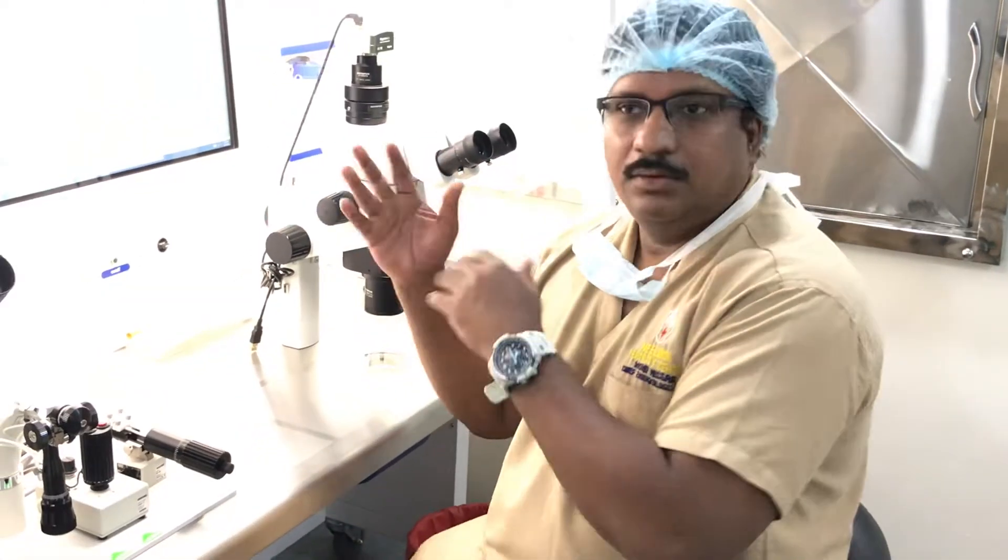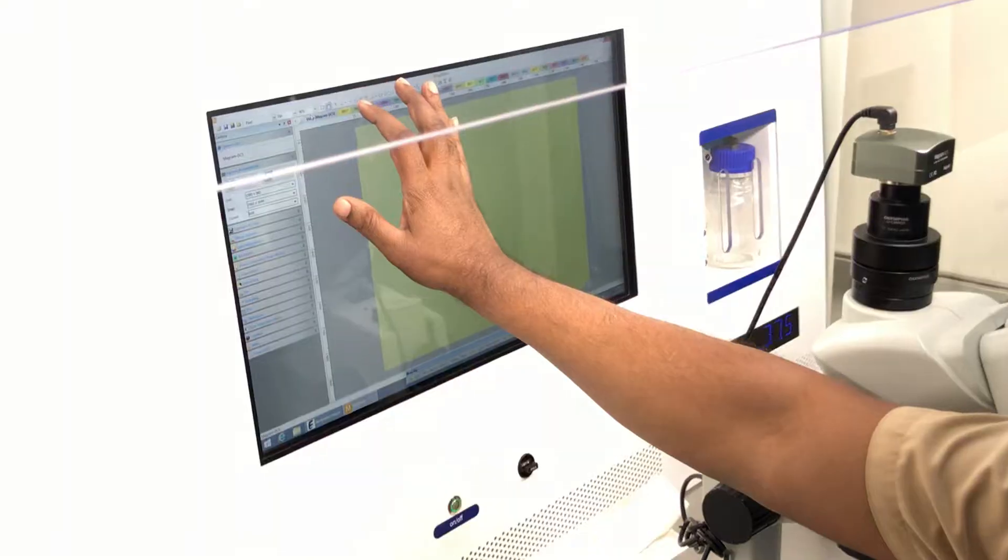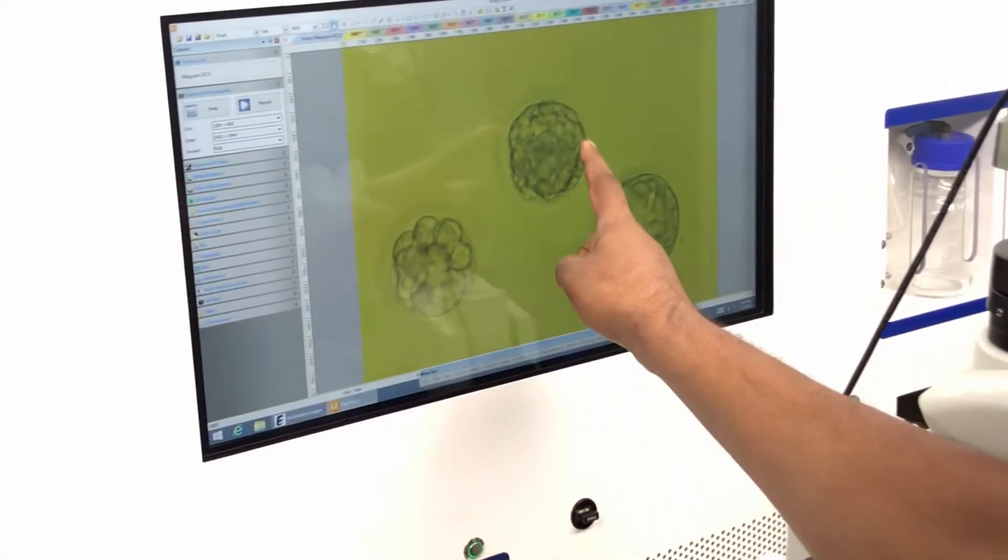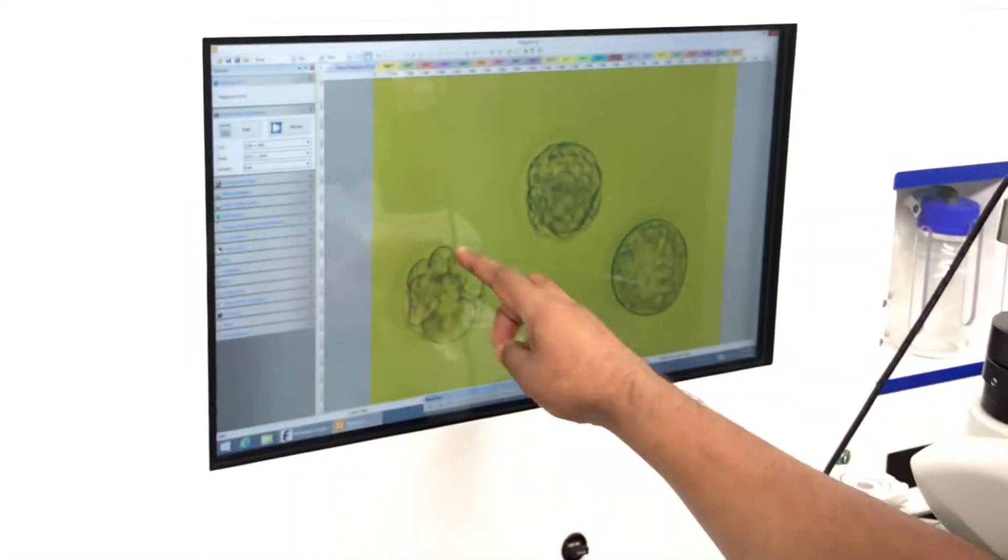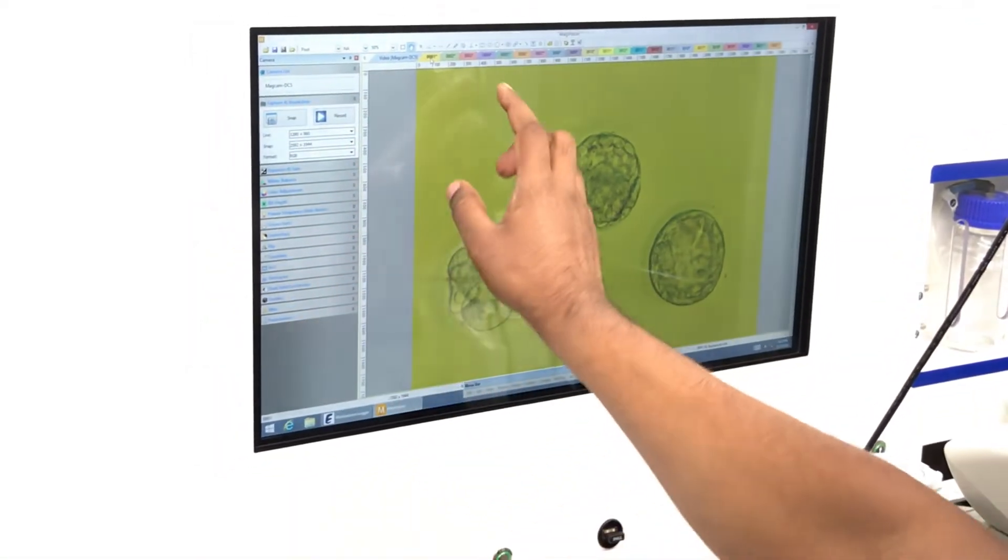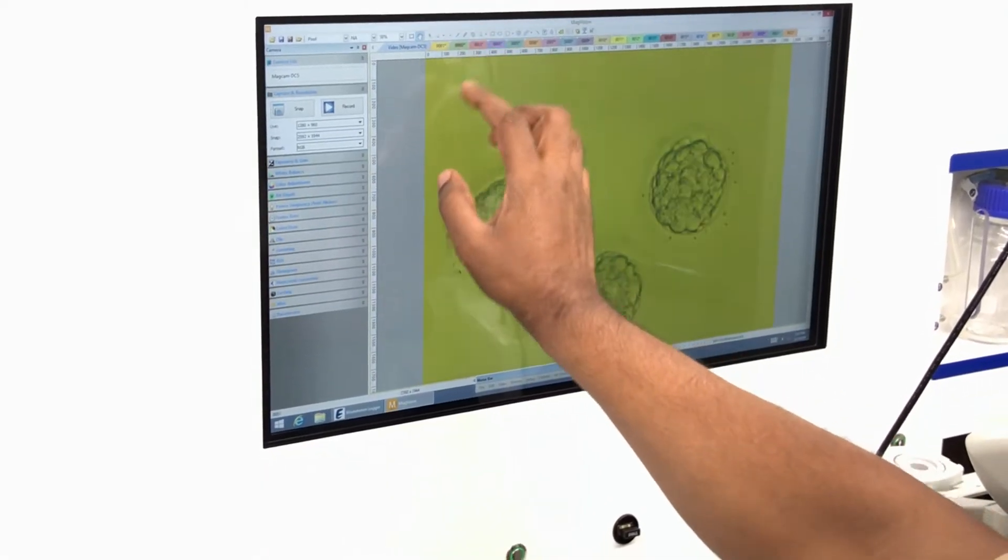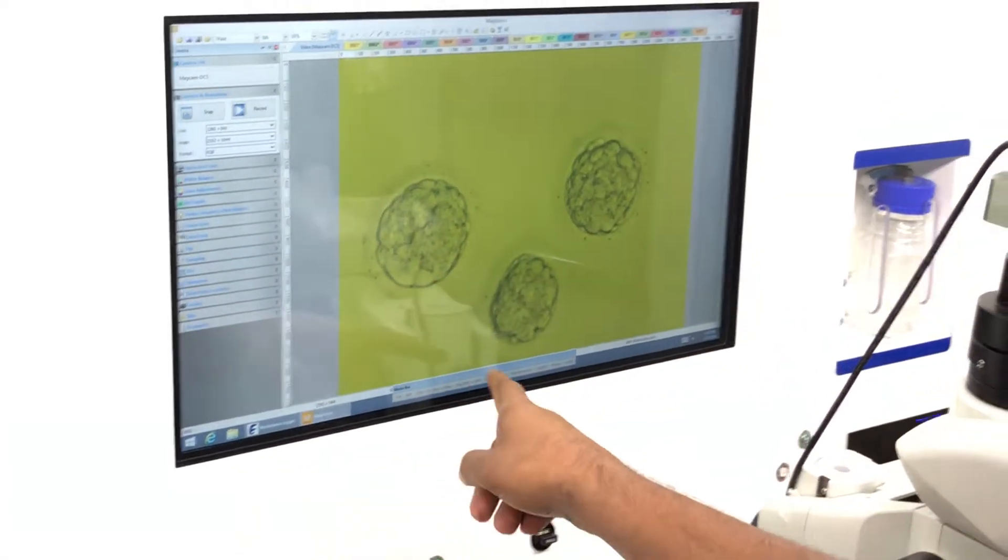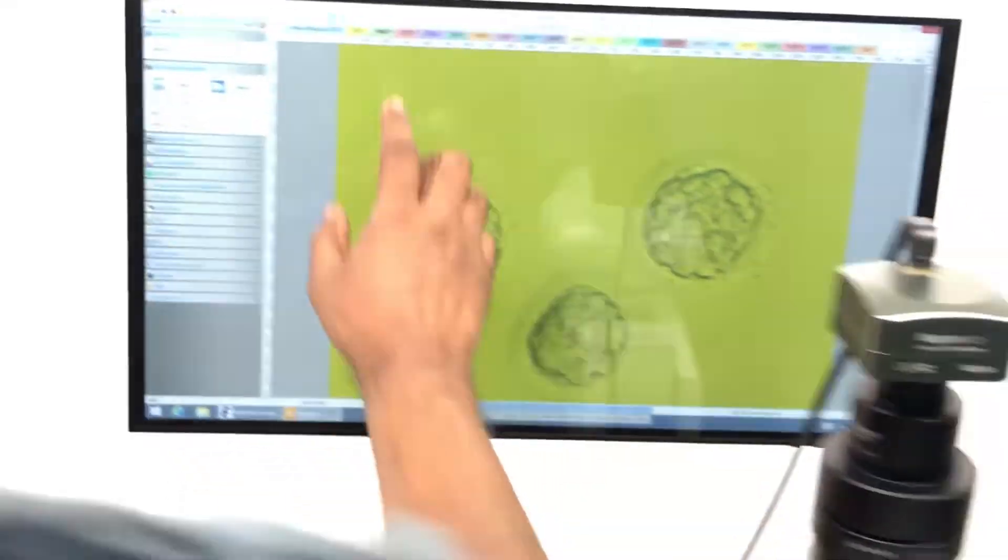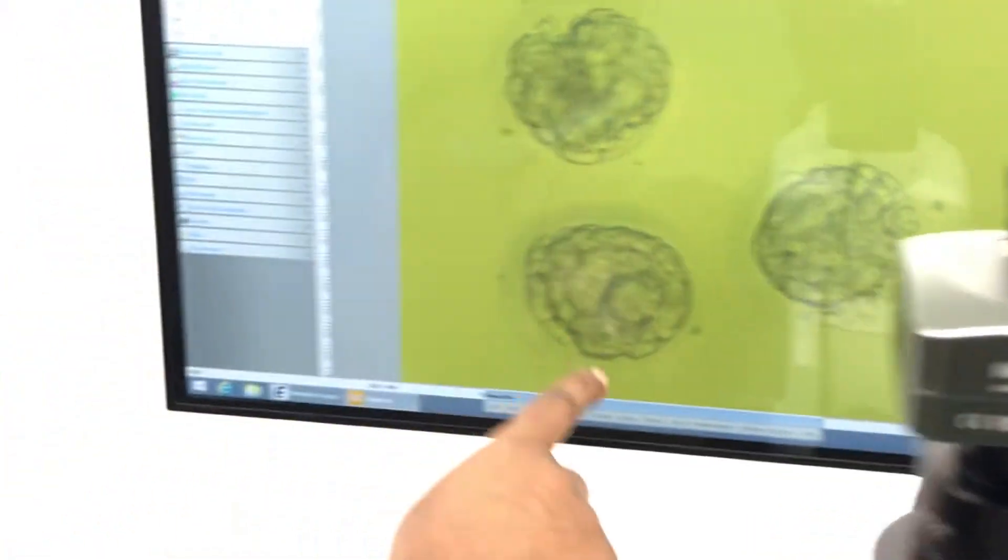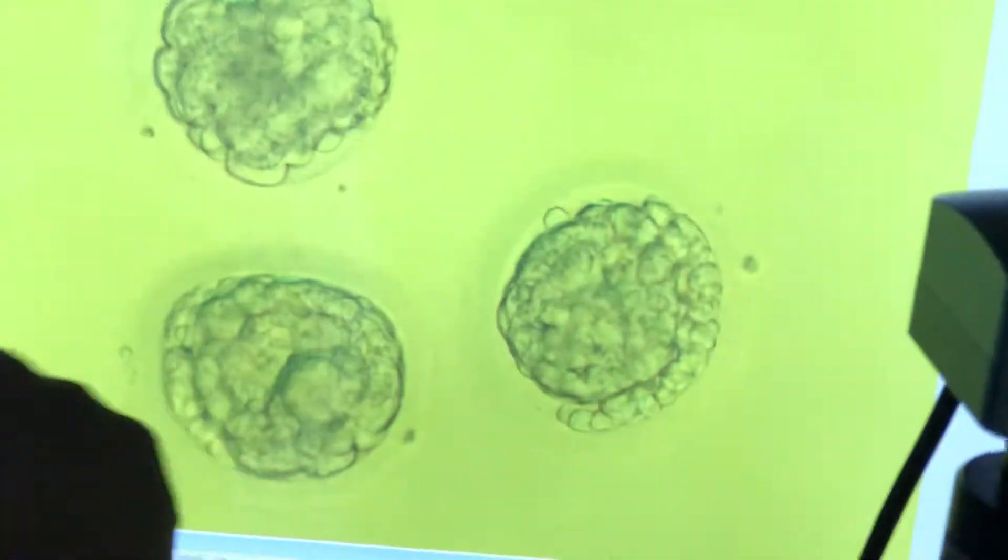Patient number one has poor compaction or arrested development. Patient number two has two beautiful expanded blastocysts and one early blastocyst.